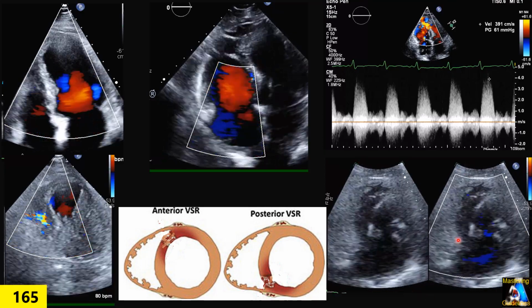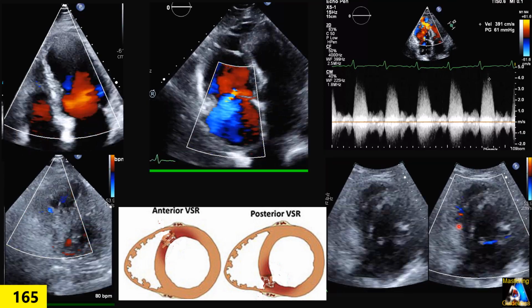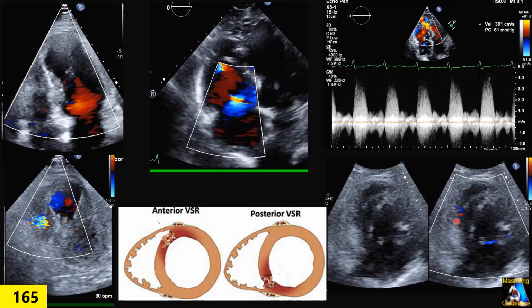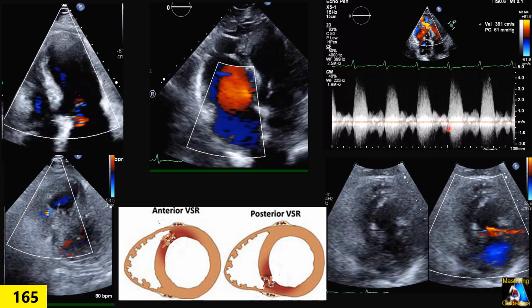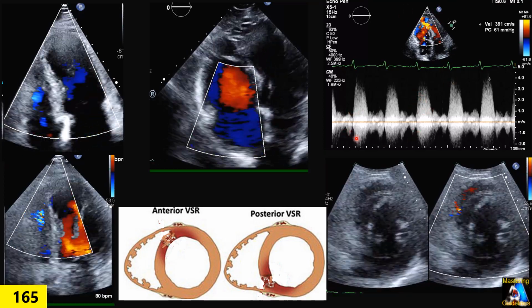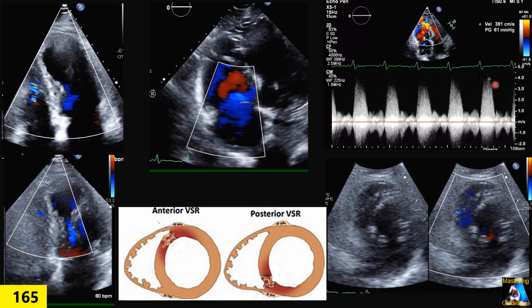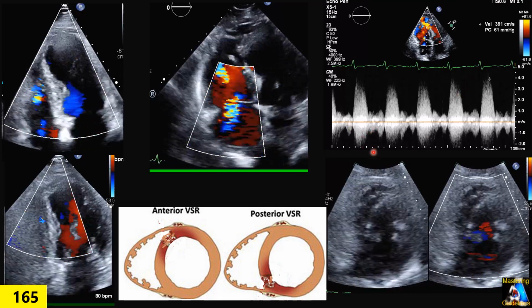If you put continuous here, you will see a high gradient if there is any shunt. If it's artifact, you can detect it, as there will not be any Doppler. Another tip is that whenever you do continuous, for example on tricuspid or mitral, and you see a bidirectional jet and high velocity, for example here close to 5, 6, there are two reasons.